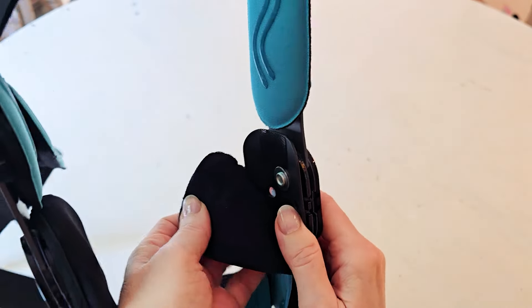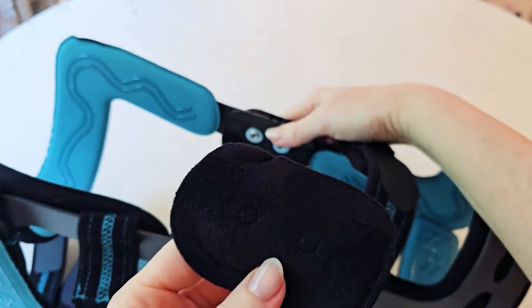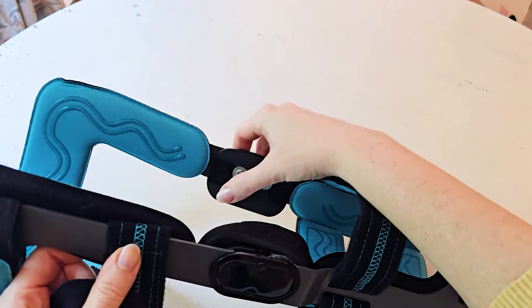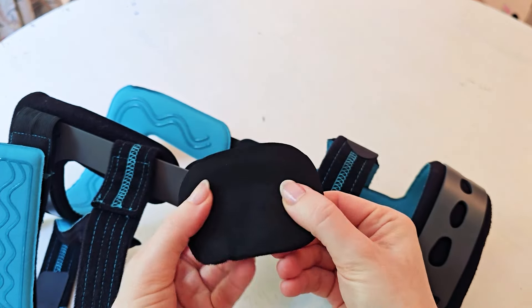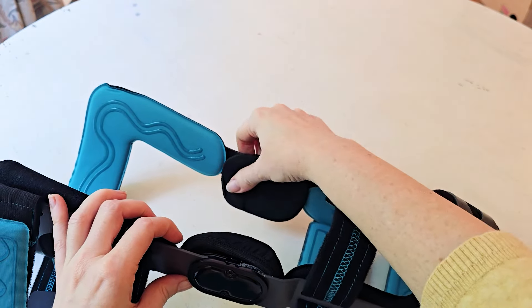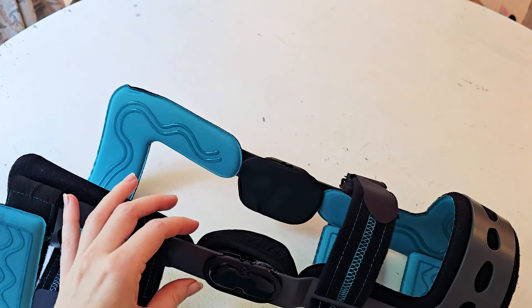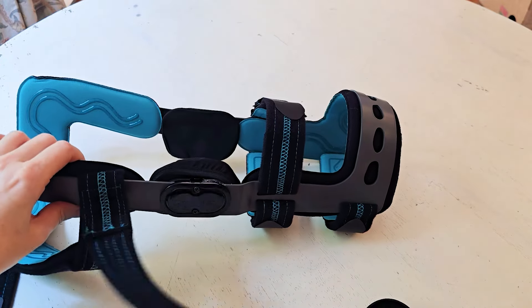Right now I'm taking off the inside pieces around the hinges. They have foam pieces that can be adjusted — you can add more foam to get a better fit, and you can also remove these pieces along with their covers and wash them all. That's huge for sweat or debris, keeping it nice and clean.